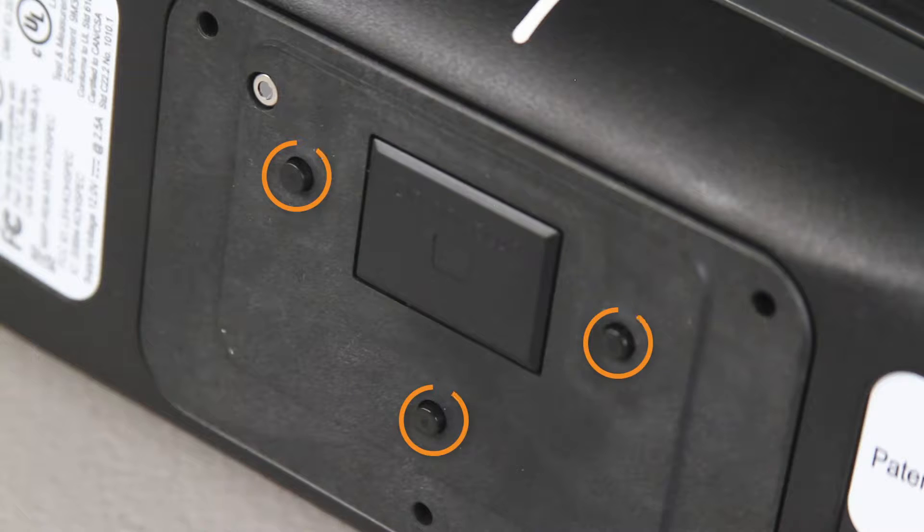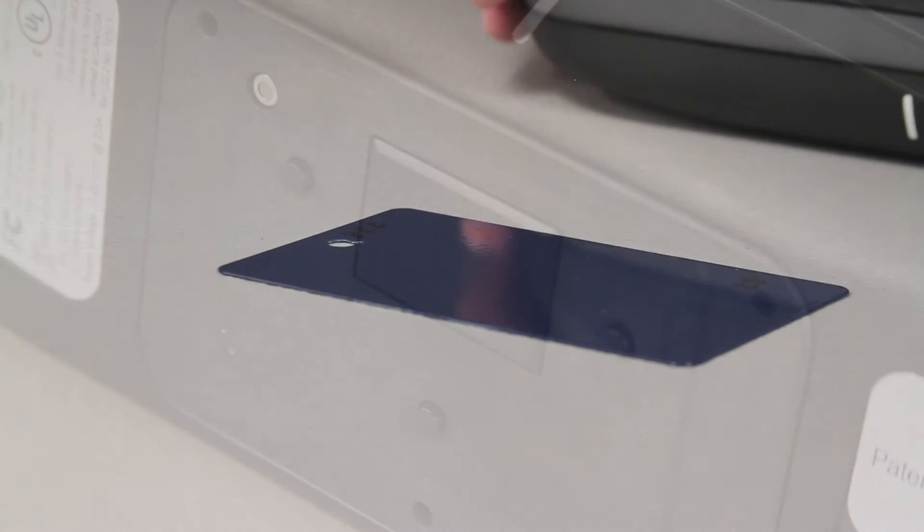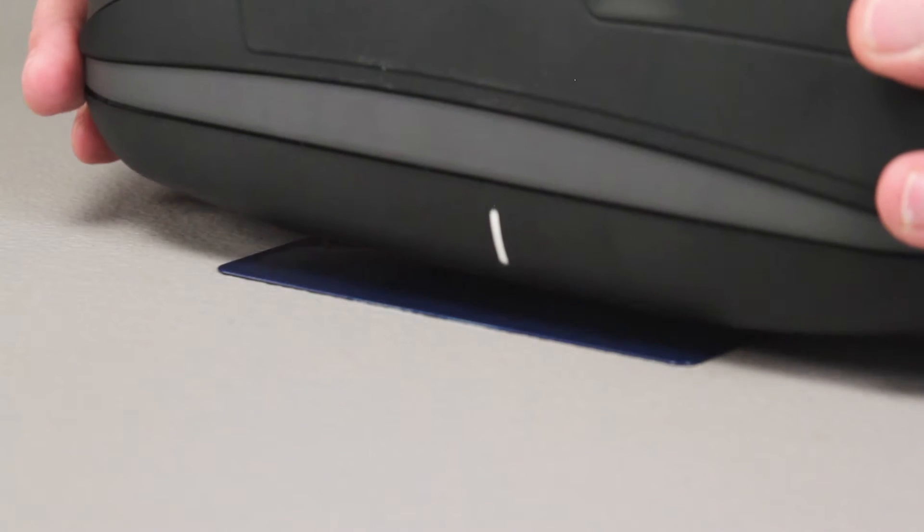There are three pressure sensors on the bottom of the device to ensure the proper measurement of your sample. These sensors require an even amount of pressure to be applied across all three before a measurement can be triggered. Use the white line on the side of your instrument to help line your instrument up with the sample you're measuring.